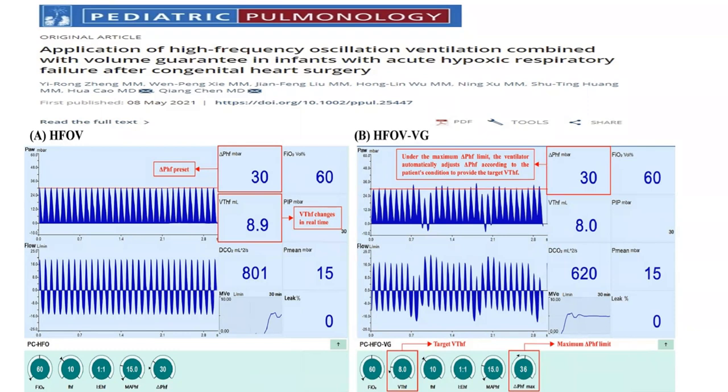I'm not sure, as Adib said, that we're using high frequency for a sick patient. First of all, we don't have very sick respiratory-wise patients, unless they came from OR with like injury to the lung, reperfusion or transfusion related injury. That's why we don't need to use high frequency on very sick post-op cardiac patient with open chest, because I don't think it's practical.